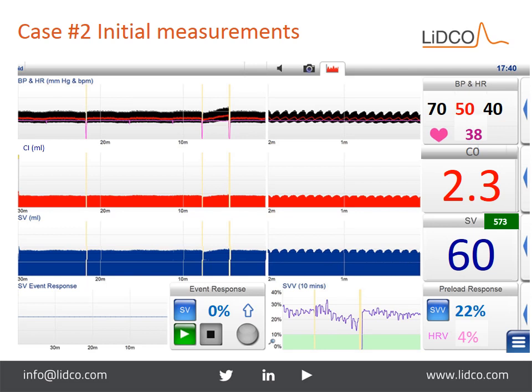So let's march it out. Is he perfusing adequately? No. Does he need volume? Yes. Will he respond to volume? Yes, according to our stroke volume variation of 22%. Everything we see here, we know he will respond. So, are you suspicious of a certain shock yet, given his mechanism of injury?